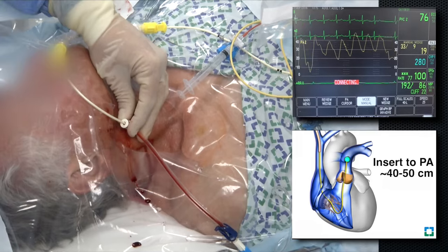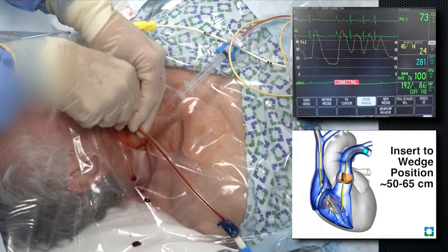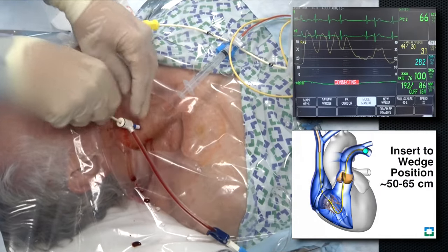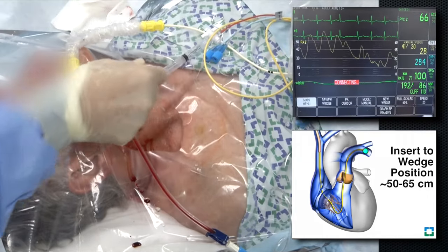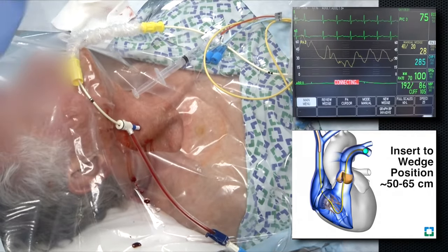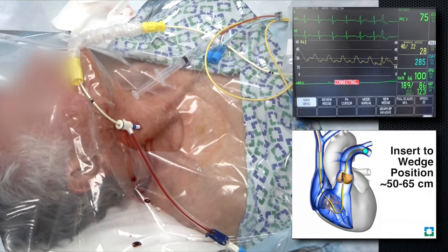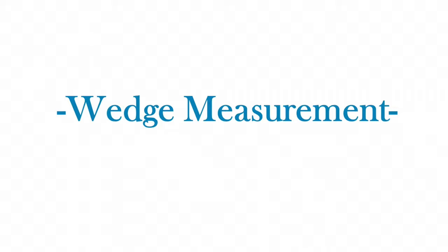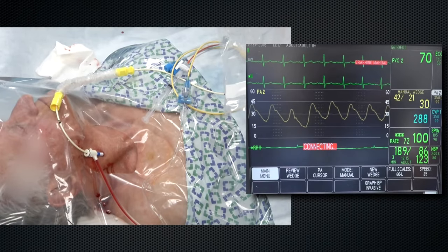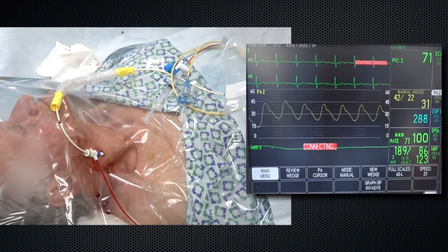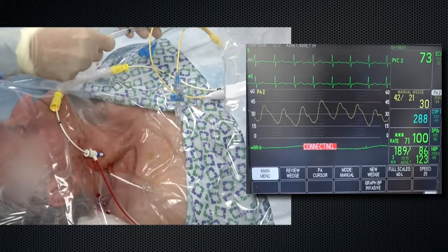When necessary, the PA catheter may also be advanced under direct fluoroscopic guidance. The catheter is advanced with the balloon up in the pulmonary artery until the pulmonary artery waveform diminishes and a wedged waveform is obtained. At this point, it is important to passively deflate the balloon to avoid complications. After obtaining accurate pulmonary artery pressures, a pulmonary artery occlusion pressure or wedge pressure may be obtained. Before inflating the catheter balloon, confirm a pulmonary artery catheter waveform on your monitor.